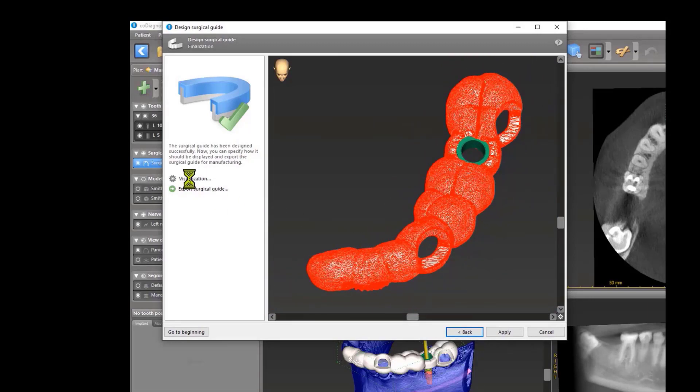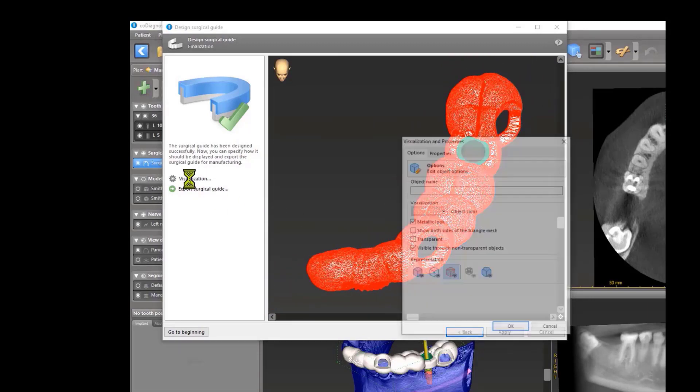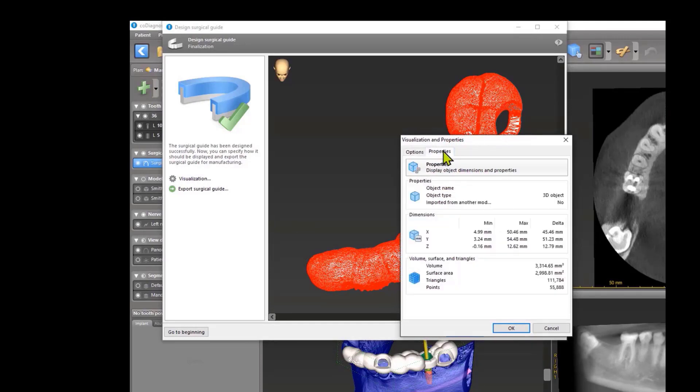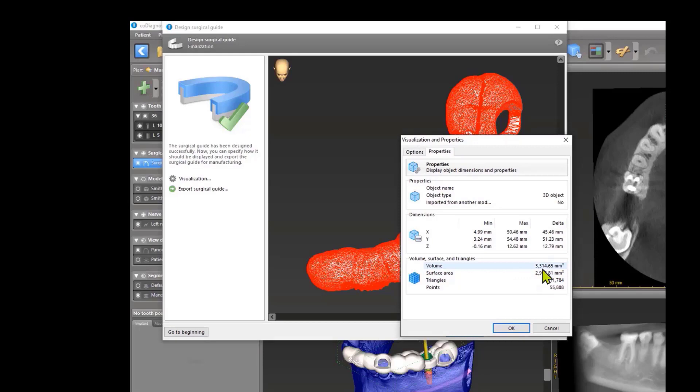And another possibility is, if you want to know, maybe it's interesting, go on properties and you see my guide has 111,000 triangles and a volume of 3.3 milliliters.